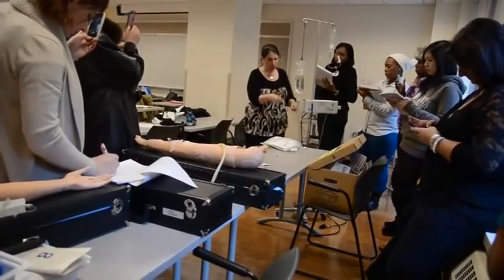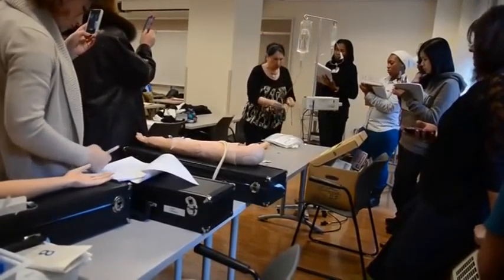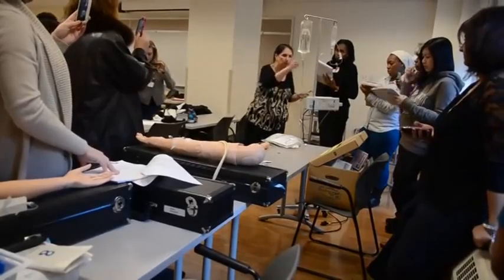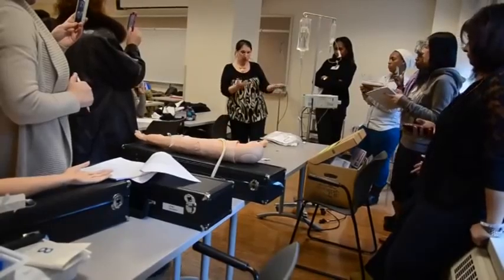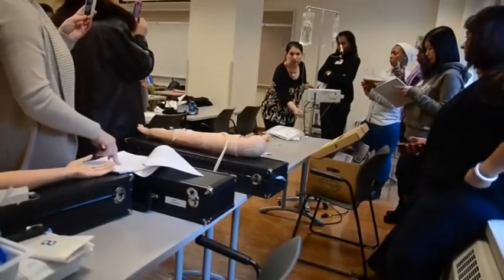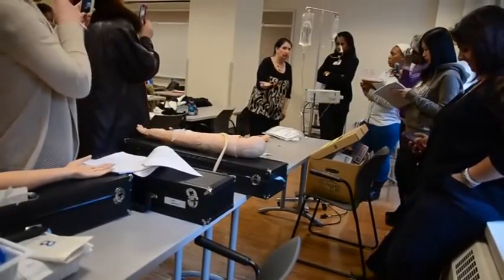This tubing that was on the primary line — that's 96 hours. So now I'm going to come in, put this back up, and I have to re-regulate this because I fooled around with it. I'm going to go back to this and make sure it's at the right drops. You don't need a saline flush — why would we need a saline flush? The patient already had an IV going. It's flushing already. We don't need a flush.